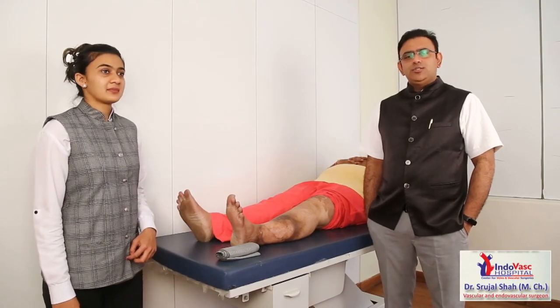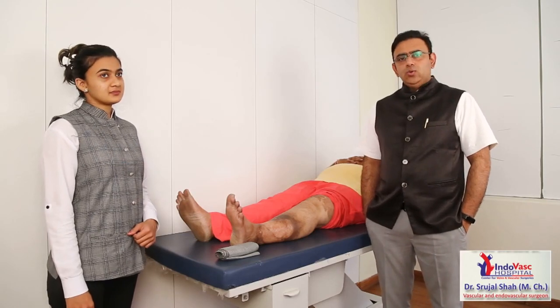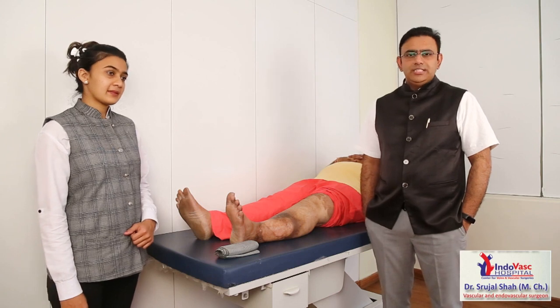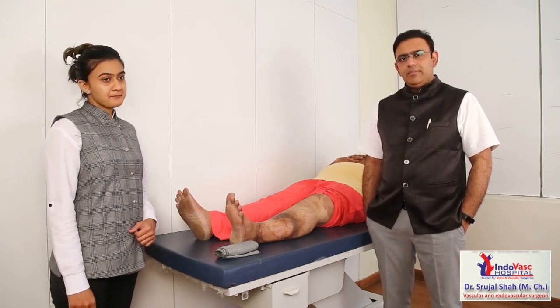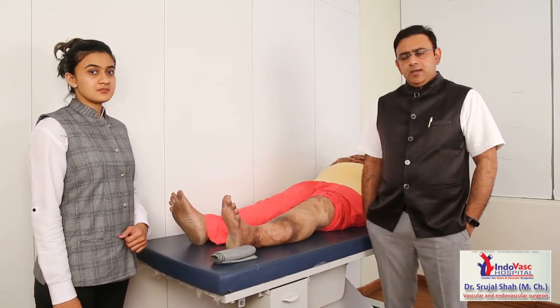Good morning everyone. I am Dr. Srujal Shah, a vascular and endovascular surgeon. We do a lot of venous ulcer treatment and manage chronic venous insufficiencies. Today we are going to demonstrate the compression bandaging method — how to apply a long stretch elastic bandage.